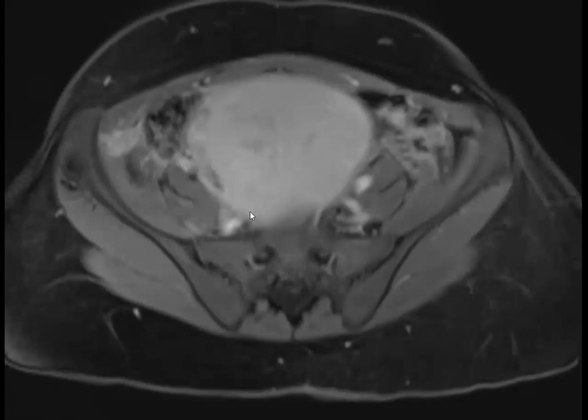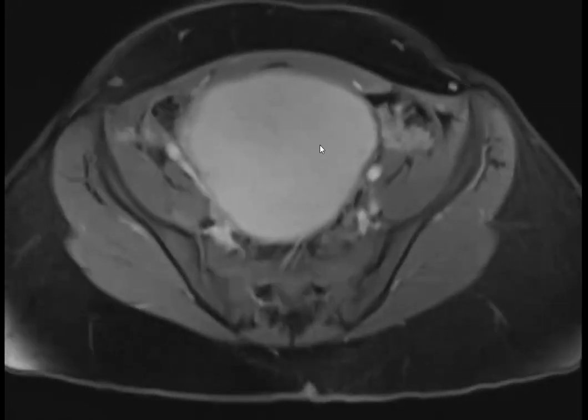But if you have an endometrioma in your ovary or adjacent to your ovary, you're going to want to look for any solid components, because they can have malignant degeneration, usually into endometrioid cancer, but also into clear cell carcinoma. Okay, I'm going to pull up the ultrasound.